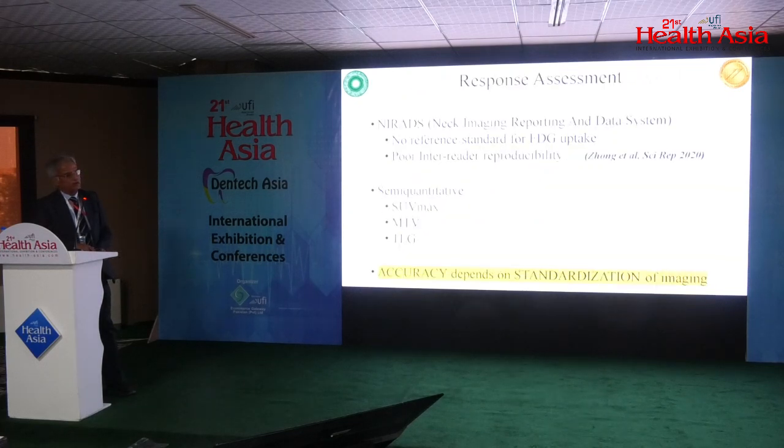Response assessment. The American College of Radiology has also issued NIRAD, the Neck Imaging Reporting and Data System, but the limitation with NIRAD is that there is no reference standard for FDG PET-CT uptake. Therefore, there is significantly poor inter-observer reproducibility, and as a result most of the nuclear medicine fraternity does not use the NIRAD category. What we commonly use are 3 metabolic parameters, which are semi-quantitative: SUVmax, metabolic tumor volume, and total lesion glycolysis.